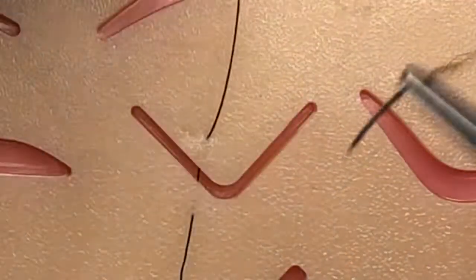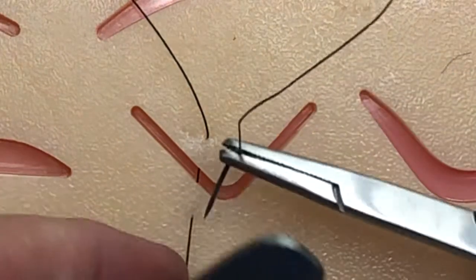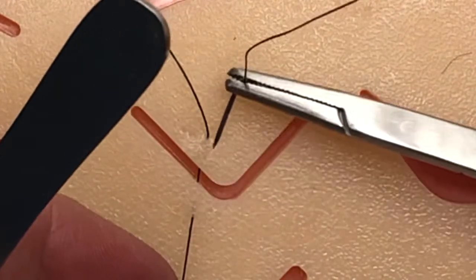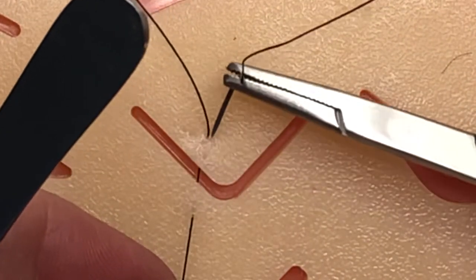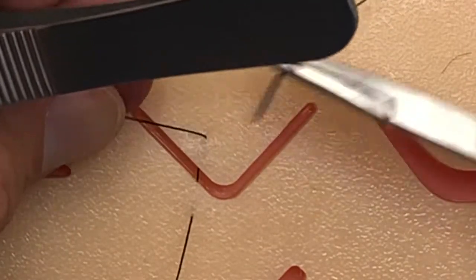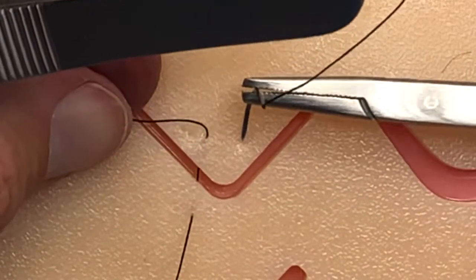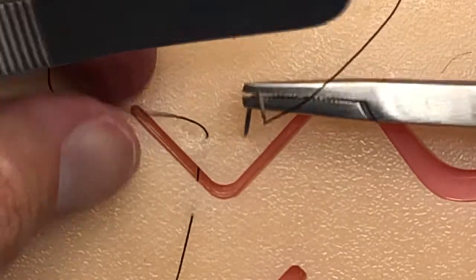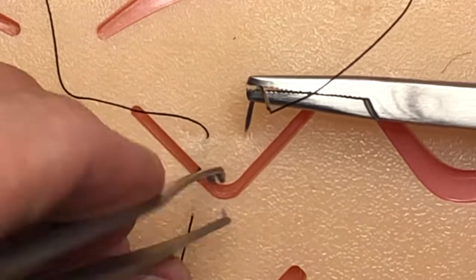I'm going to turn the needle around the other way. So I've come in here, across and out of the tissue, down about that way. So I really want to try to be as symmetric as I can. So I'm going to come right down about here.